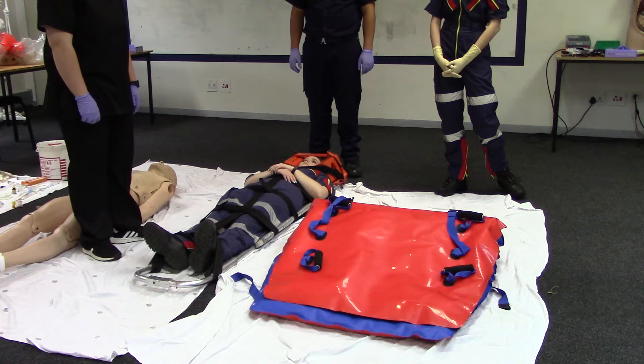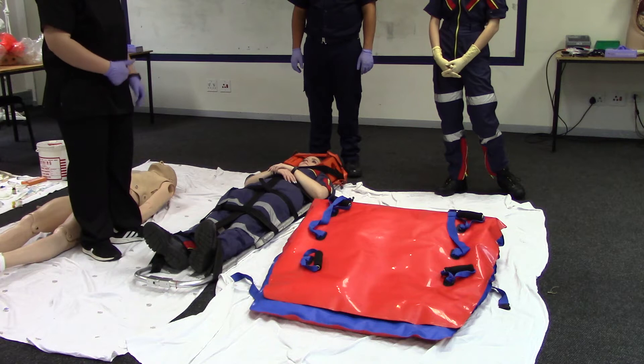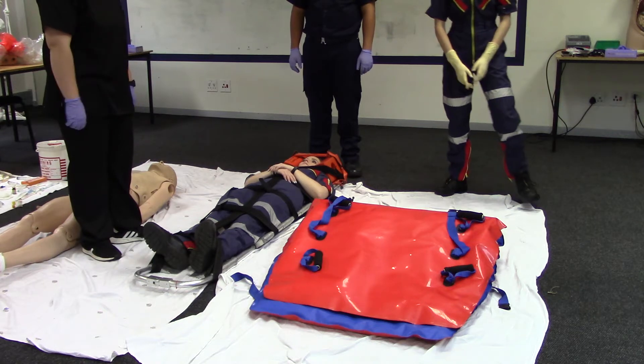As per the scoop stretcher skill, ensure adequate spinal immobilization is in place. Then prepare the vacuum mattress for application.